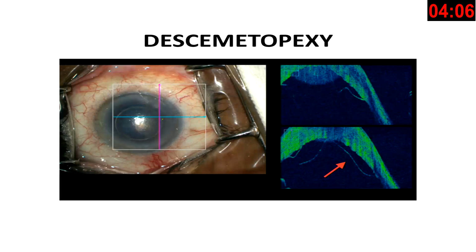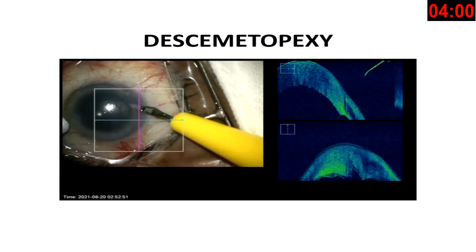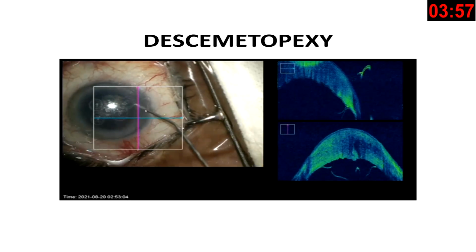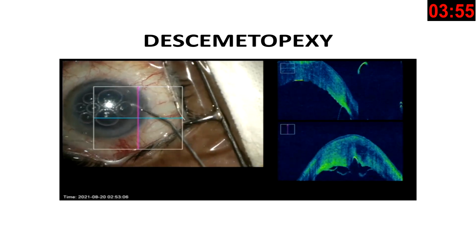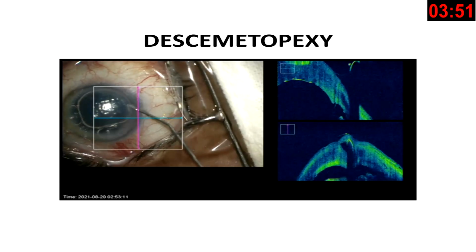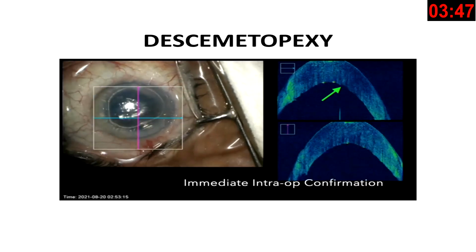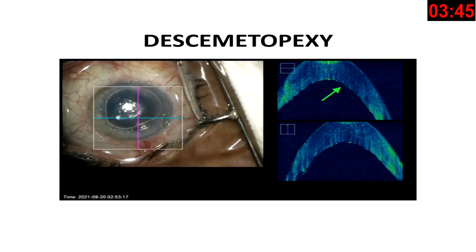So in this video, you can see this is intraoperative OCT. You can clearly see that there is a linear Descemet membrane detachment. Here I am making a side port, and we inject non-expansile SF6, and this is guided. So you know that you are going into the right plane, and you can see that as you inject SF6, there is immediate reattachment of the DM membrane.